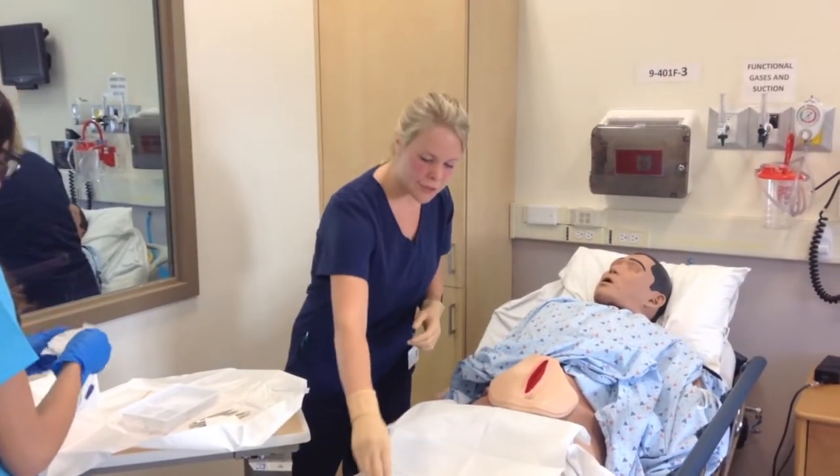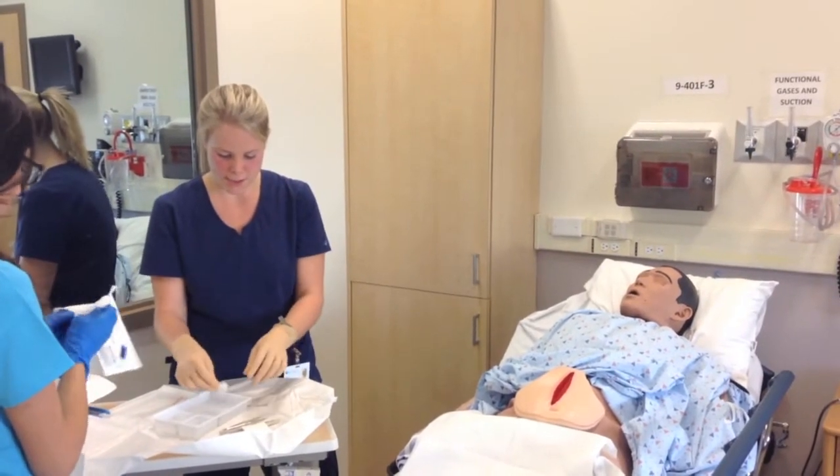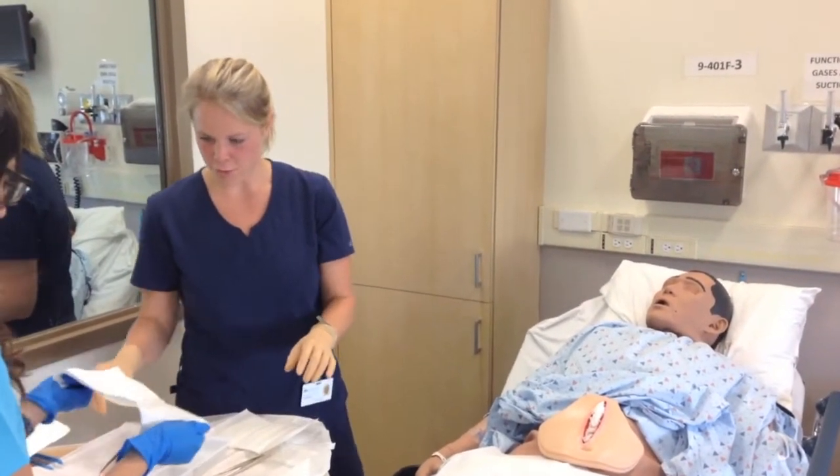Now we just want to pack the wound with some saline-soaked gauze. We don't want it over-packed and we don't want it under-packed — just to help with the recovery process.